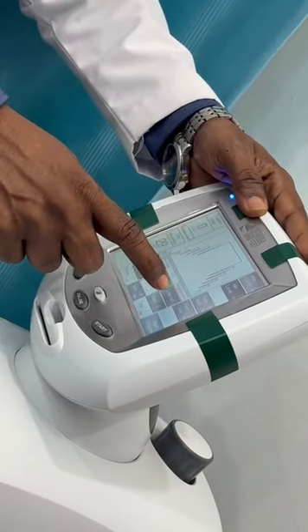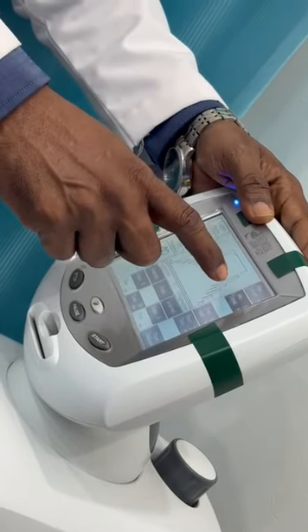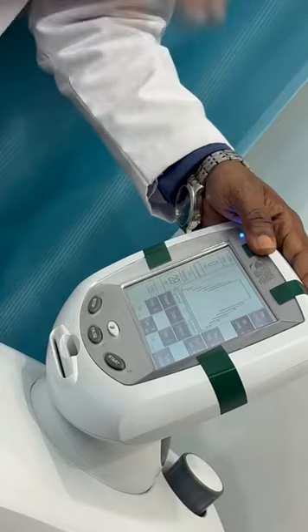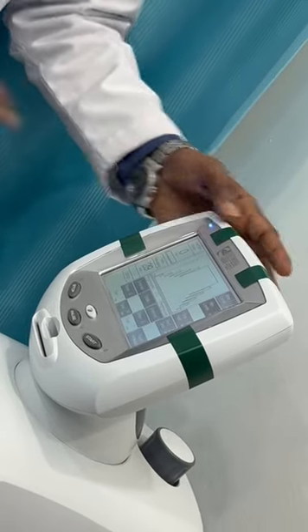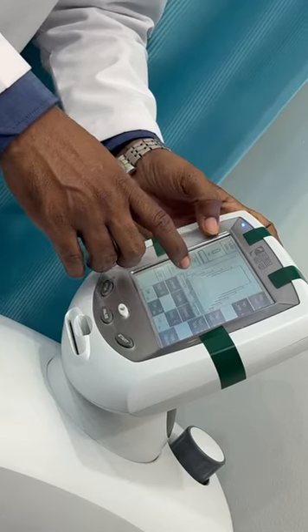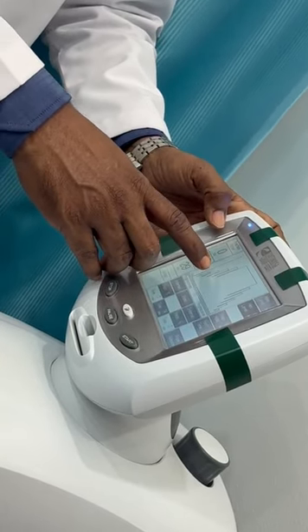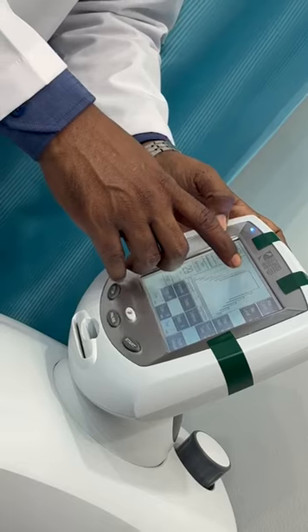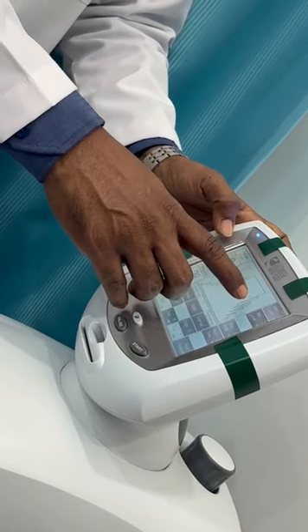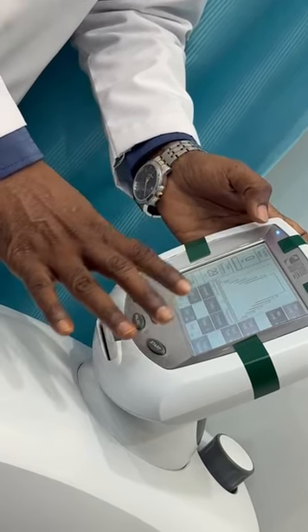Okay, then after that it slowly comes down. Intermittent is hold, then it comes down, release, then hold, release, but the force will be maintained. Okay, how much traction force is maintained here? Now, for example, here is 2 kg, 4 kg, 5 kg, 6 kg, 7 kg, 8 kg. The 8 kg will maintain, then 7 kg, 6 kg. So it will maintain. Finally, it comes to 0.